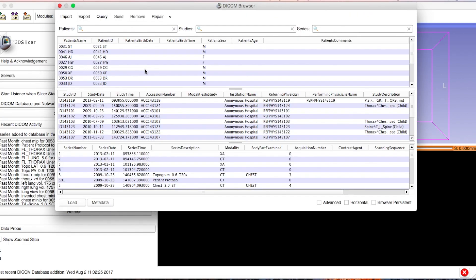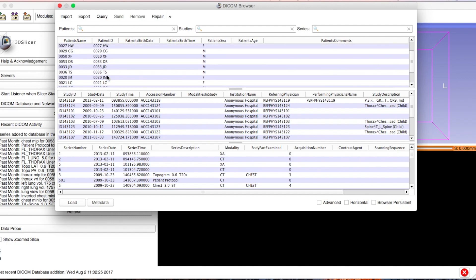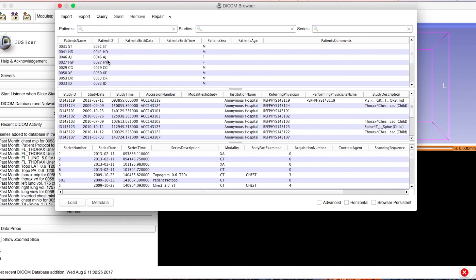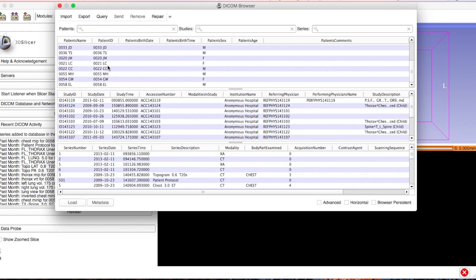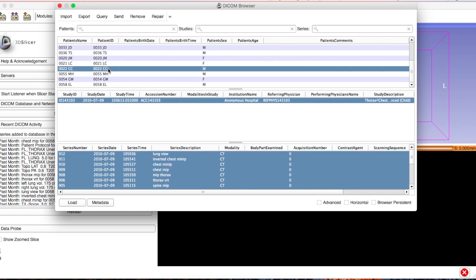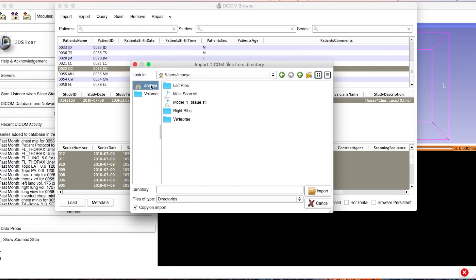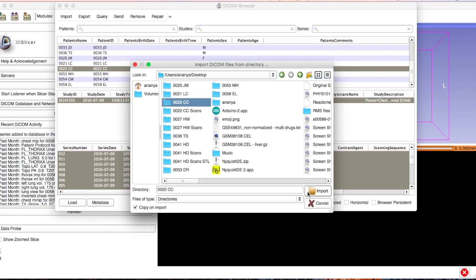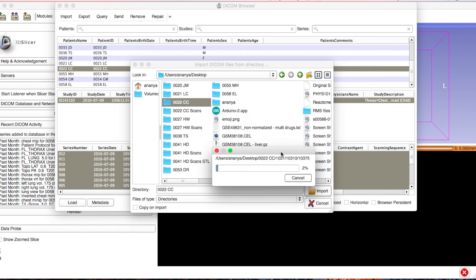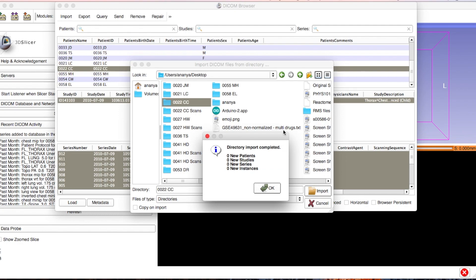Now I'm going to load a file. On the left-hand side, right under 'Welcome', it says 'Load DICOM Data' — click on that. The first time you do it this will be completely blank, but since I've uploaded many files it already shows in the directory. Go to 'Import', import the file, and always click 'Add Link'.